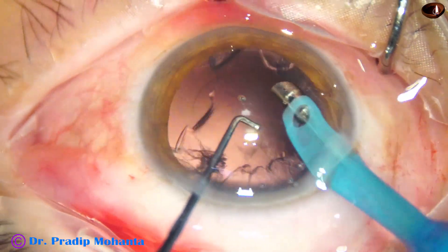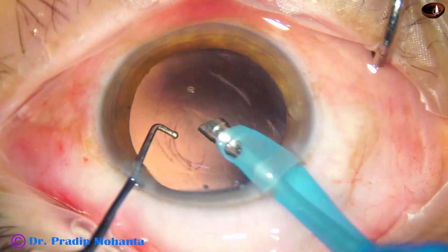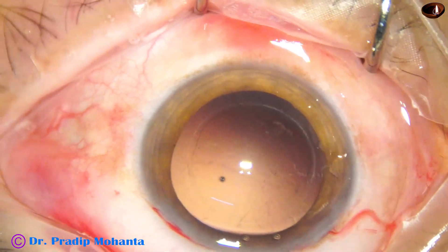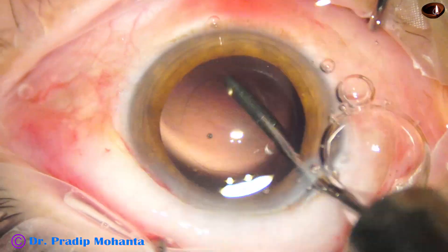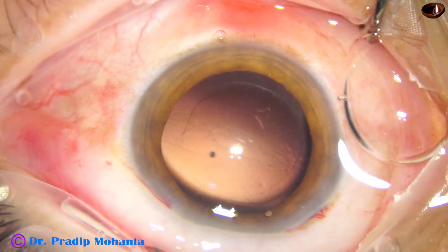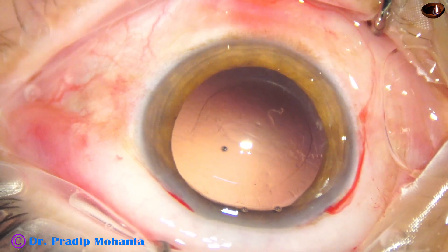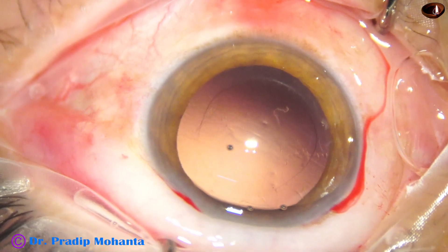Now see how we can remove the cortex by the handpiece itself. The bevel is down or sideways and we have to be very careful at this time. We must support the posterior capsule by the ball-tipped sustainer, use adequate vacuum — not too much — and we must develop a reflex. If we catch the posterior capsule, we should be able to stop immediately and use reflux to release it. Cortical cleanup is done. There are some lens fibers sticking to the posterior capsule; we can polish it using the irrigating cannula.